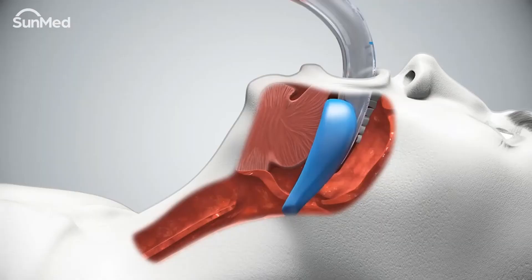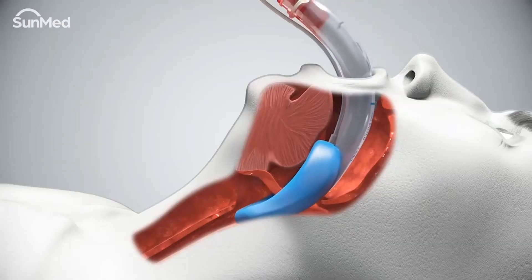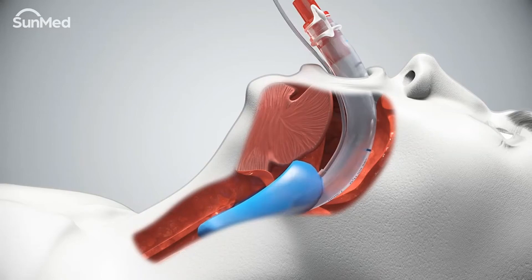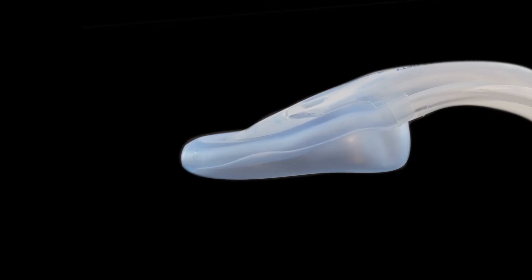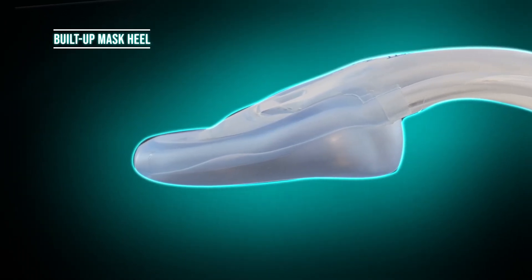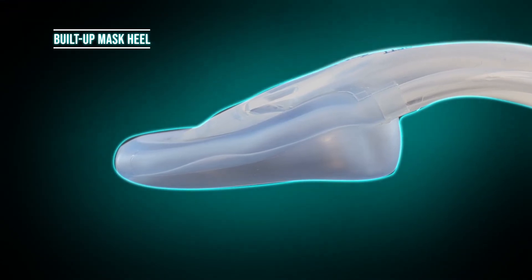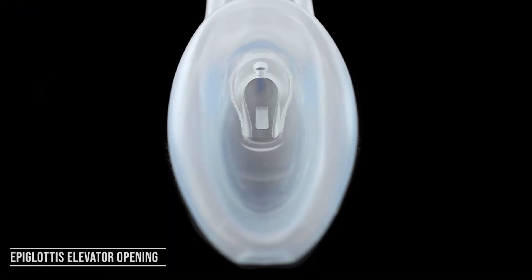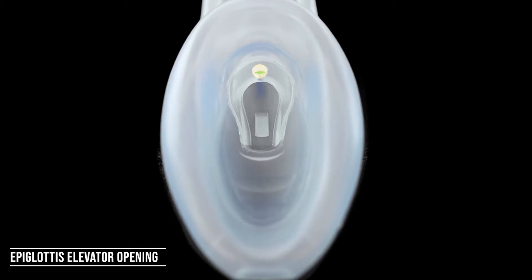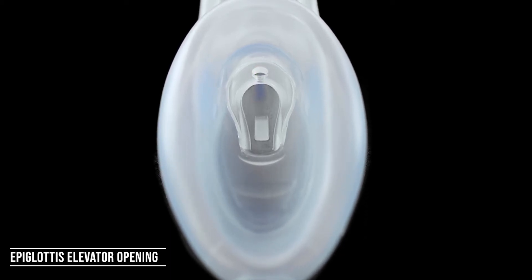The cuff is self-pressurizing, controlled by inspiratory and expiratory pressure, removing any need for manual inflation. As we take a closer look at the Air Q3 cuff, we see it was designed with a built-up mask heel, improving the seal. There is also an epiglottis elevator with an opening allowing for transfer of air if the main inlet becomes blocked.